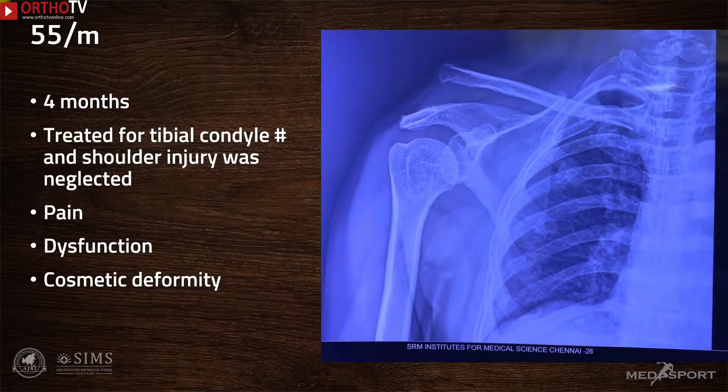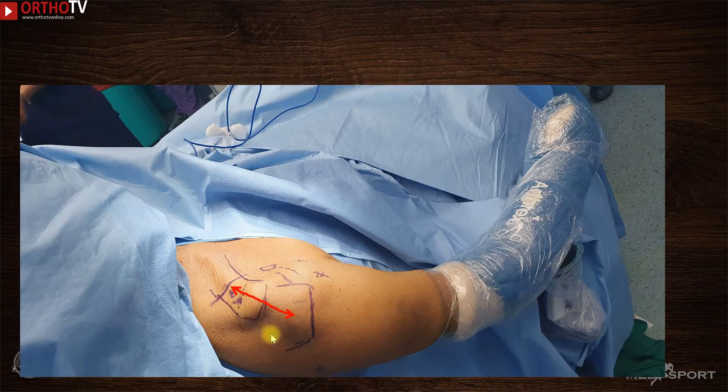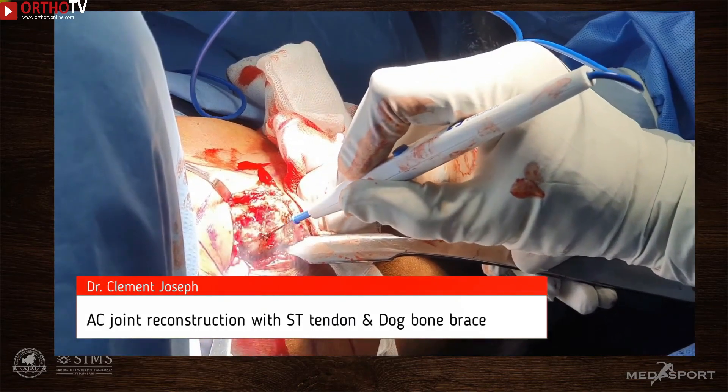This is a 55-year-old gentleman who presented four months after an injury. A tibial condyle fracture had been treated initially, but the shoulder injury was neglected. He presented with pain, severe shoulder dysfunction, and a prominent cosmetic deformity. All landmarks are marked, and a horizontal incision is made spanning the lateral end of the clavicle. A mark is made approximately 25–30 mm from the lateral end of the clavicle, which will serve as the starting point for drilling the coracoclavicular tunnels.